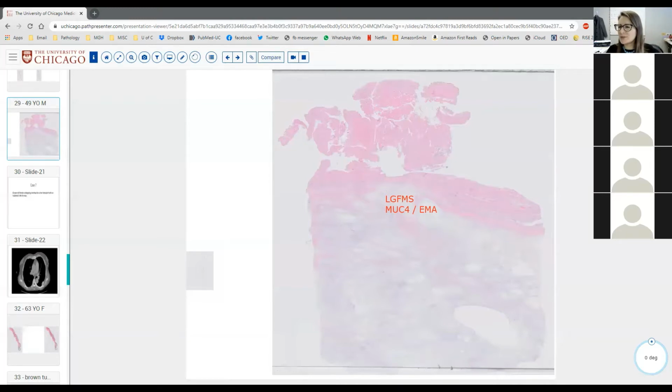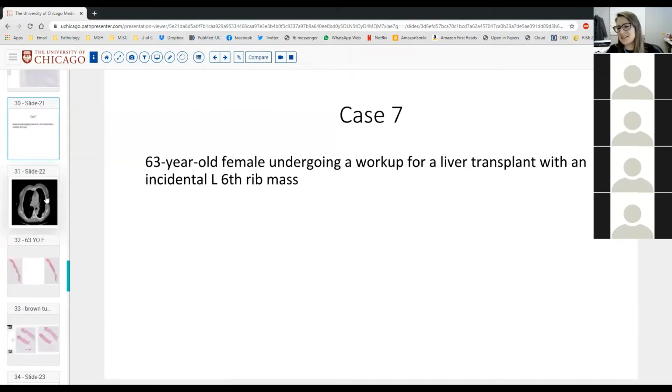Okay, so that is additional. I can't remember, Heather, if we did those stains on the biopsy, probably. Yeah, I think they were negative. Great, good. Okay, questions or comments? Yeah, CD99 is not so helpful for this particular differential.